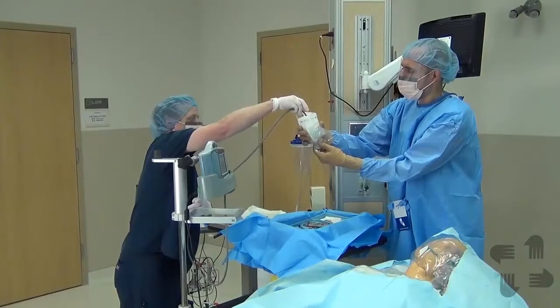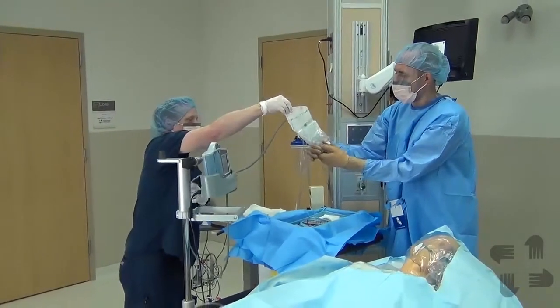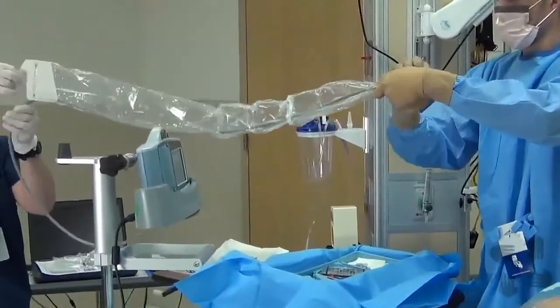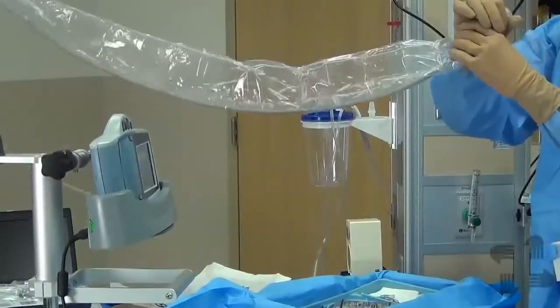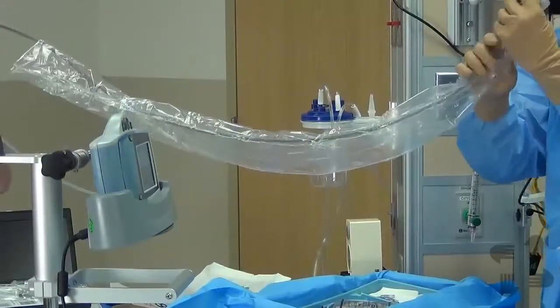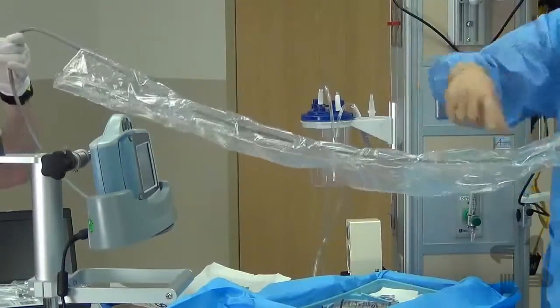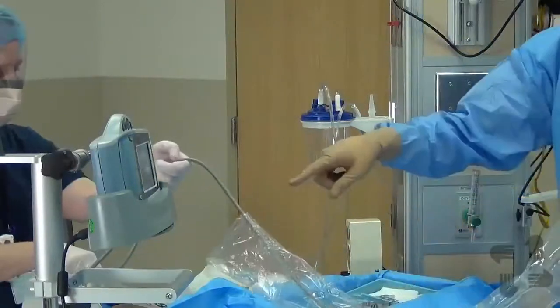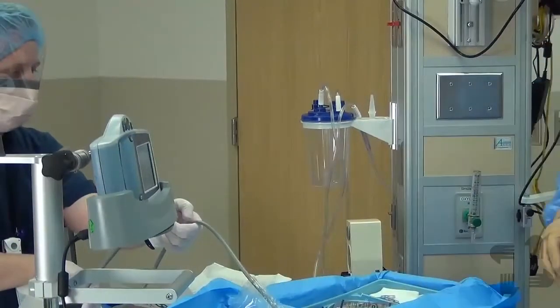Grab the tab. And I got the probe here. Now just pull it along the line. Perfect. So just be careful because this is now sterile. You give me as much length as possible without getting that in the sterile field. I'll just drape this across the patient.